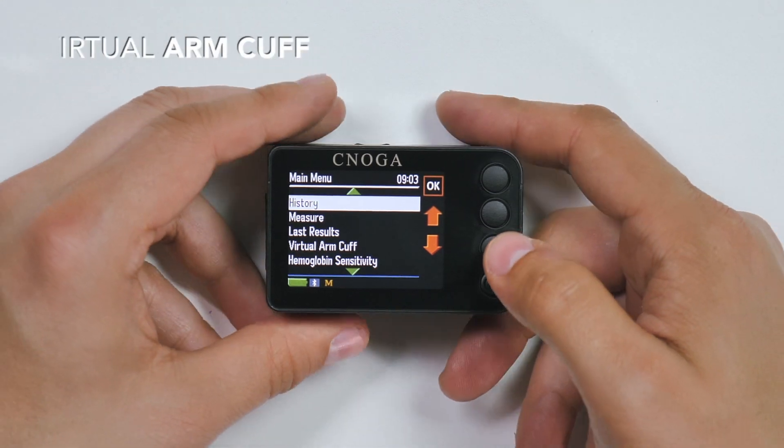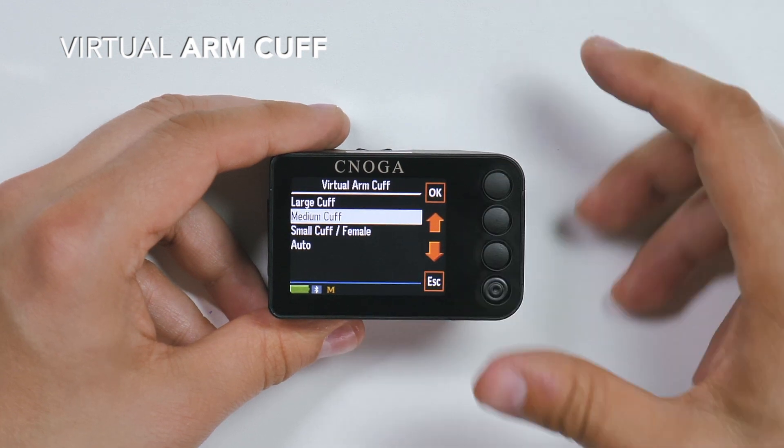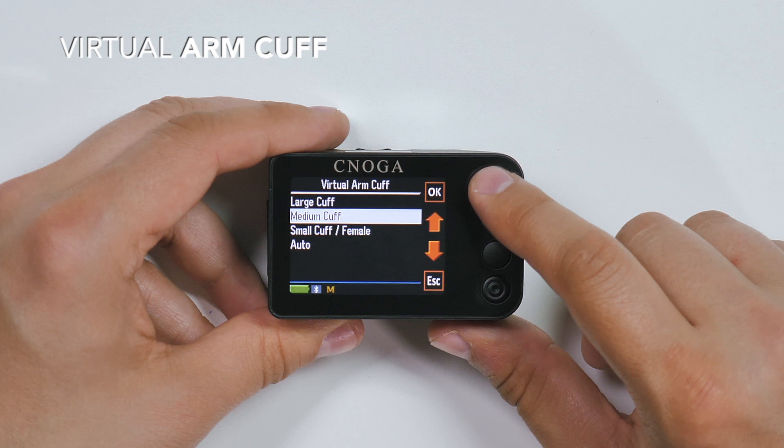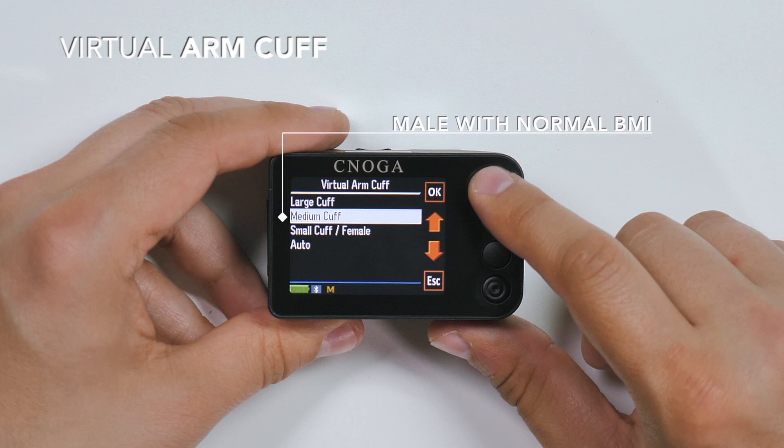Before initiating a measurement, adjust the virtual arm cuff by choosing this option from the main menu. Press the up and down arrows to select the appropriate arm cuff. A male with high BMI or people with suspected high blood pressure should choose the large cuff size. A male with normal BMI should use medium cuff size. The small arm cuff is usually suitable for women.